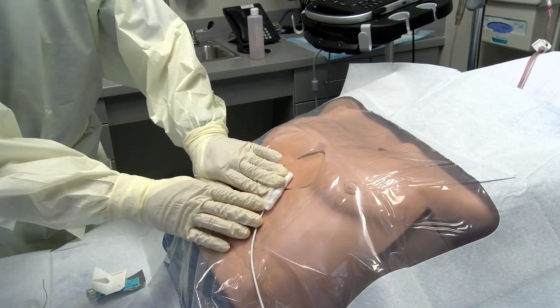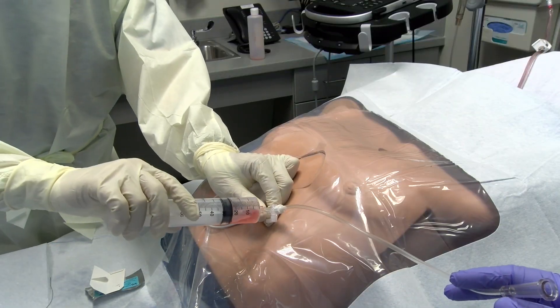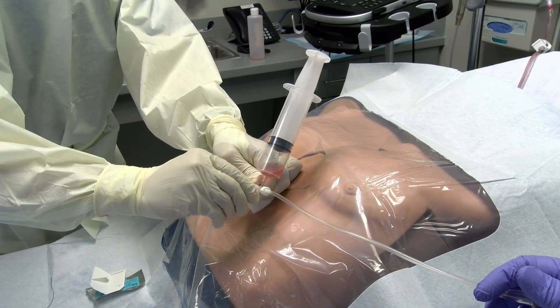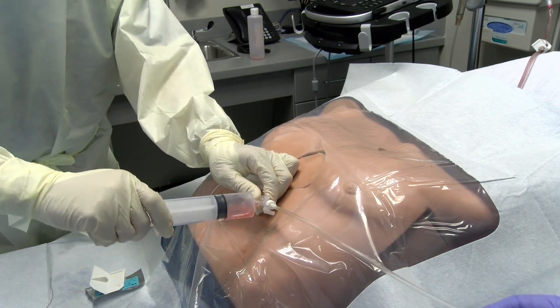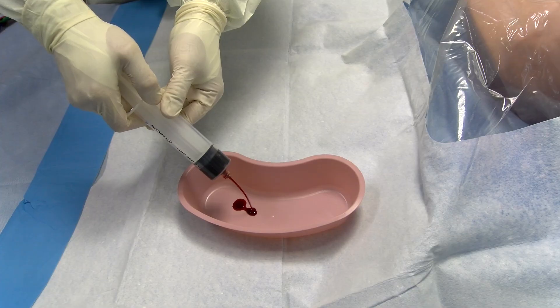If you are unsure of the needle and catheter placement, the aspirated blood can be put into a basin. Blood that has been present in the pericardial sac should lose the ability to clot, while fresh blood from the ventricle will maintain its clotting ability.